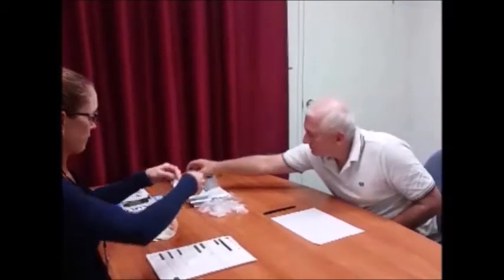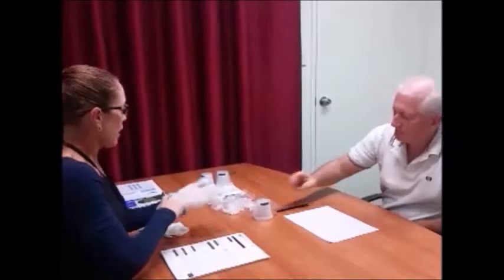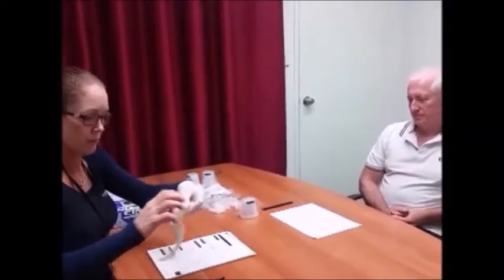Excellent, thank you. So let's pretend that we've already completed the breath alcohol test. You can refer back to the filming of the breath alcohol session on the oral fluid training video. We're going to proceed directly to the on-site urine testing. Michael, can I get you please to choose one of the cups? If you have any questions as we go, please don't hesitate to ask me, but I will explain the process as we go.